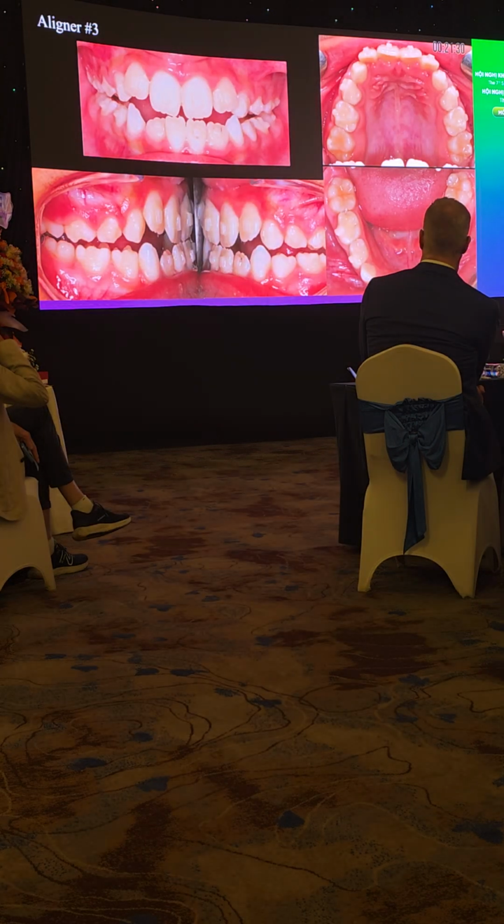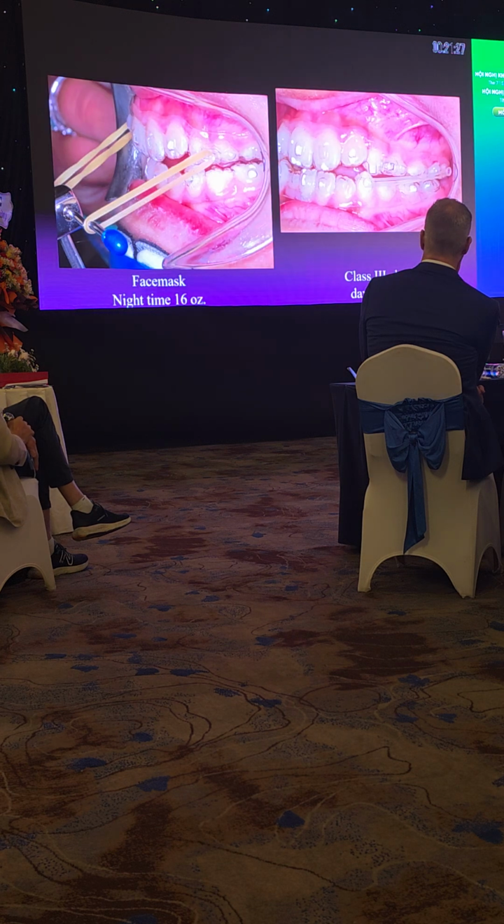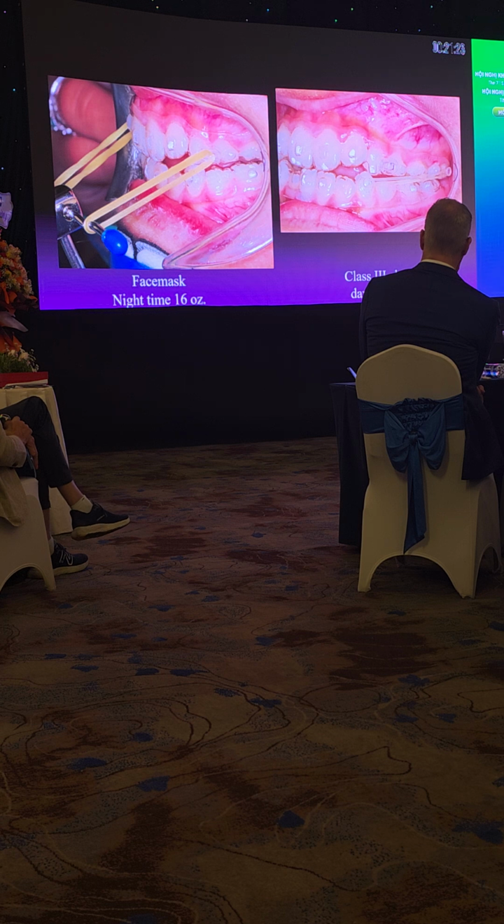So, here is clear aligner number 3, and I added on a face mask, which is kind of cool, okay? Because this particular company has a button, they call it an angel button or angel hook.